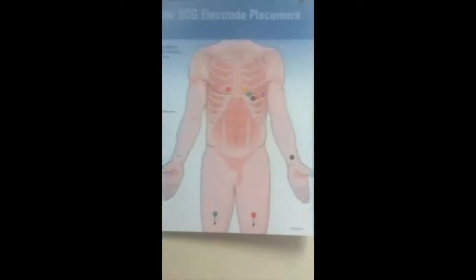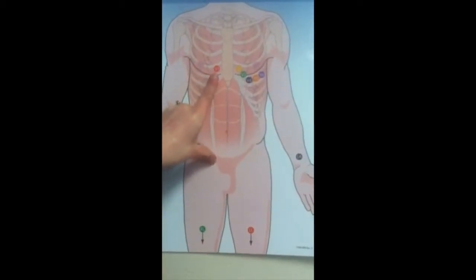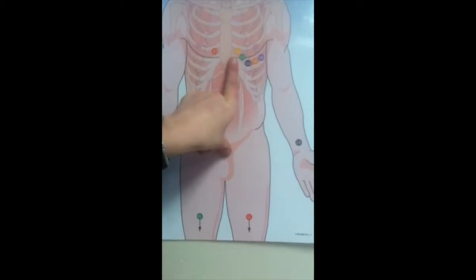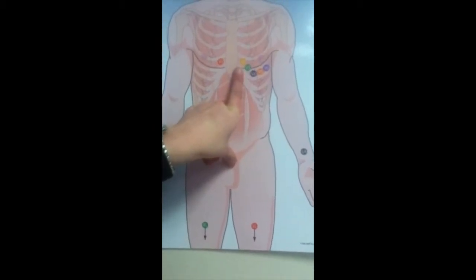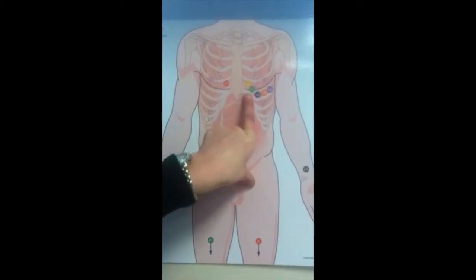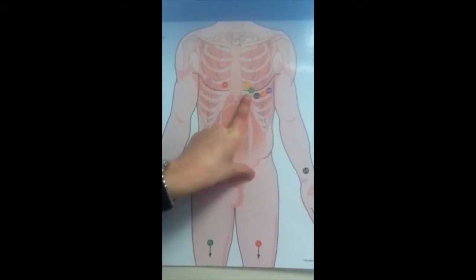The first lead is placed at the fourth intercostal space at the right border of the sternum. The second lead is directly across the sternum at the fourth intercostal space on the left border. The third lead is a step down, midway between locations V2 and V4.